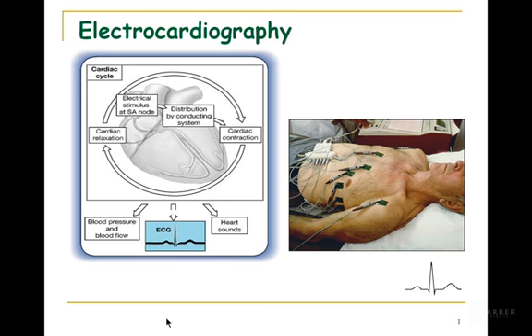And just keep in mind why we're able to do this is that electrical activity that's created by the heart is transmitted through the saline solution. We're a big bucket of saline, which is a very good conductor of electricity. This is why it's transmitted up to the body surface where we put these electrodes. We're able to look at the heart in multiple angles or views, at any given point in time, and you can get a lot of information about the general direction of the activation of the heart during that specific period of time.